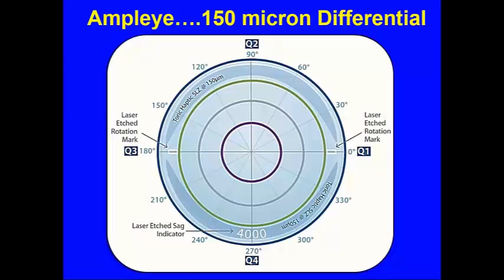With this information, we communicated that to the back side of the Ampleye design. The beauty of this is that we can now apply a scleral lens to the eye. The lens will then automatically turn to line itself up on those two principal scleral meridians. We use this to hold the contact lens into place and orient the contact lens so that the astigmatic correction can now be placed onto the front of the lens to correct any of the residual cylinder.